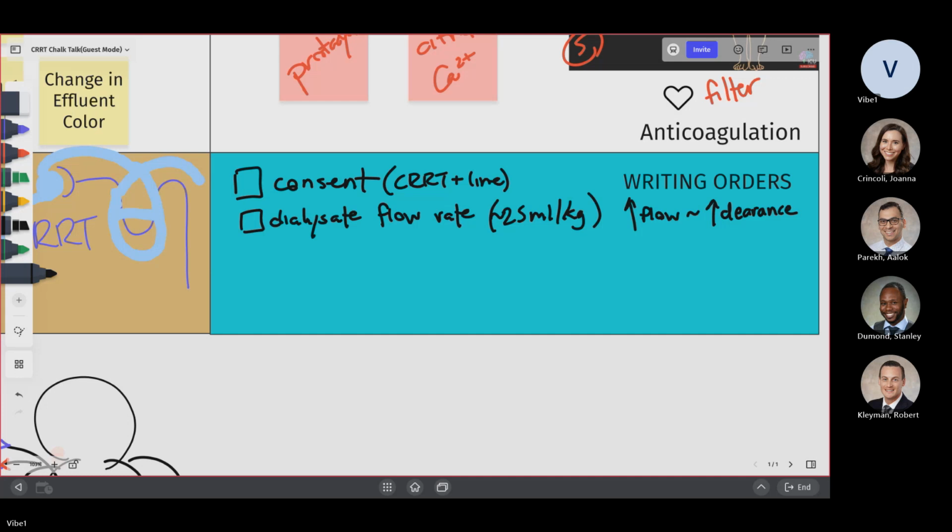Now coming to the dialysate, you could have different combinations of dialysates. You could have a variable on the potassium. You can have a 2K, 3K, 4K, 0K, 1K. You can have variations in calcium: 0, 1, 2, and 3. To make things simple, we kept every variable stable except the potassium. So potassium can be 2K, 3K, or 4K, which basically depends on the patient's potassium.